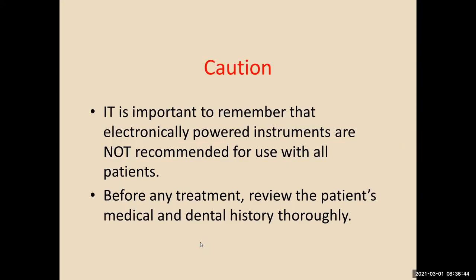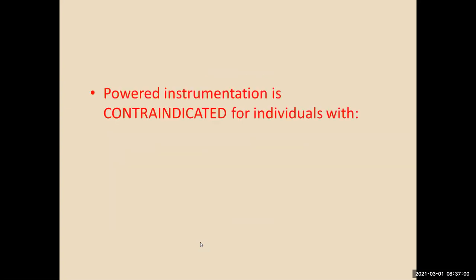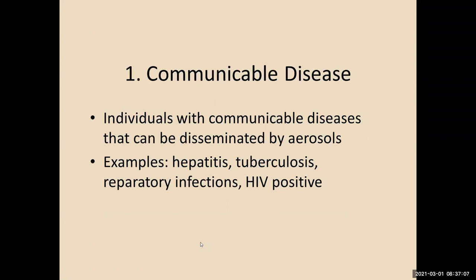What are some of the contraindications for use? It's important to remember that electronically powered instruments are not recommended for all patients. So it's important that you review the medical dental history thoroughly. Who is contraindicated? Who do you not use powered instrumentation for? Somebody with a communicable disease, all right? We are spreading aerosols all over the place, and you want to contain those aerosols.